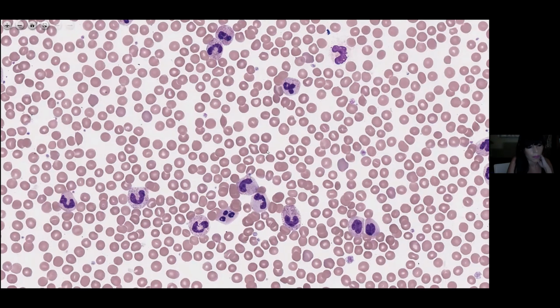So it's an area of debate, but I think from a clinical perspective, if you're going to see left shift, you're probably going to see more cells which are immature than the band form stage, I think. I don't know if you agree, Sam.